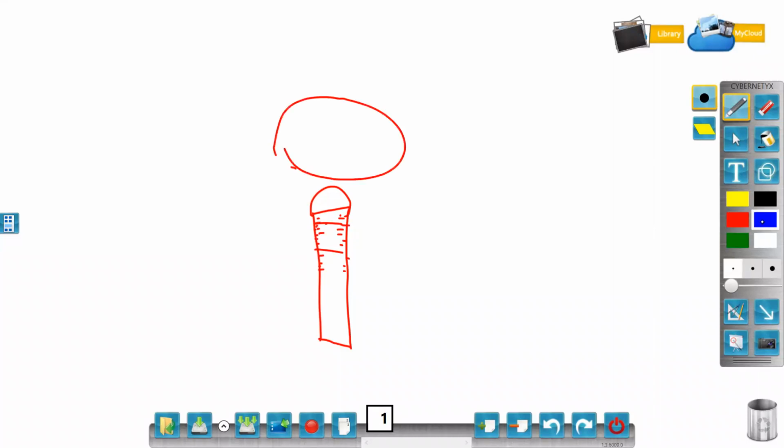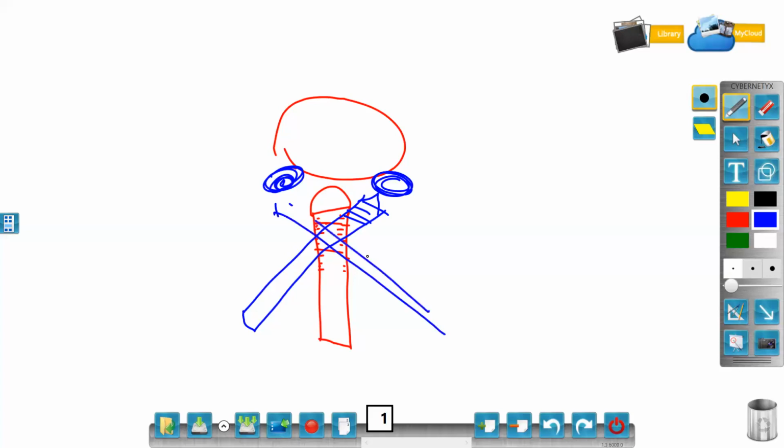When you have inserted the probe, you are thinking that the ovary will always be here and here. Then what you are doing, you are making the probe target onto this side and onto this side.